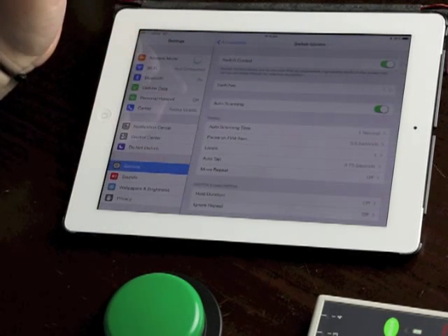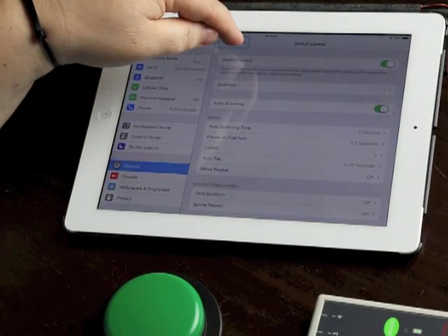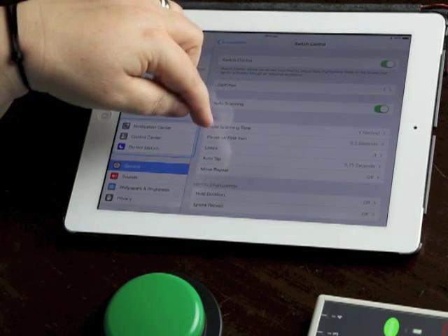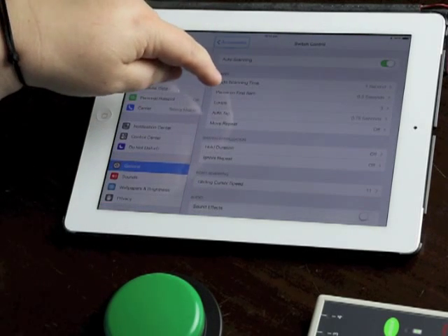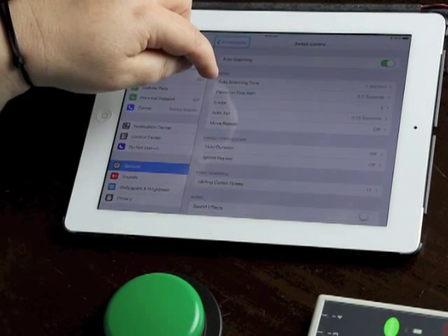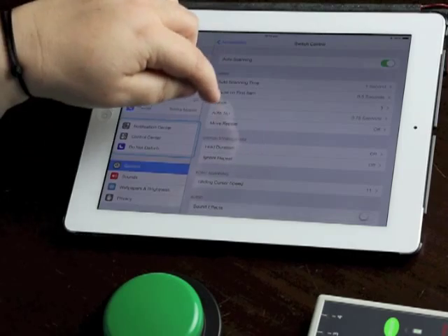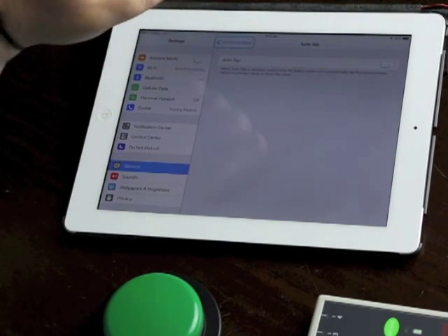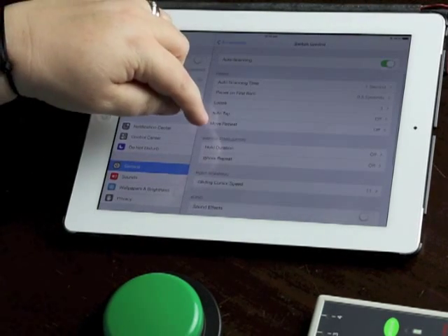I'm going back into switch control and I am going to keep going through these options. So we looked at auto tap, I'm going to turn that back off so I do get the menu popping up all the time.